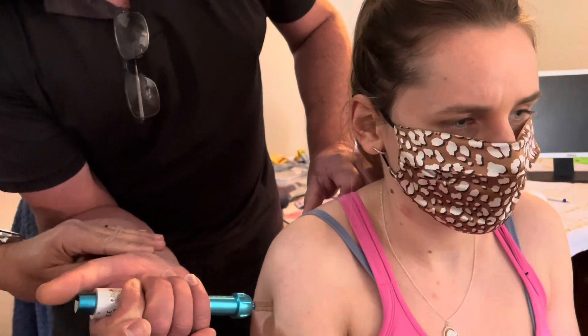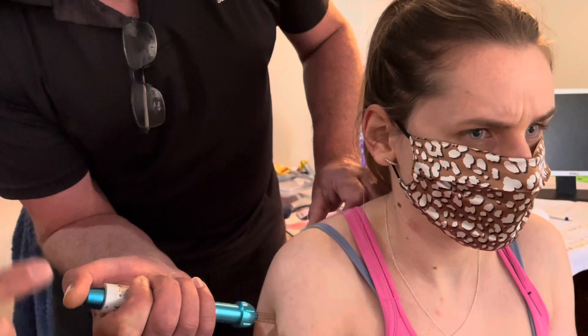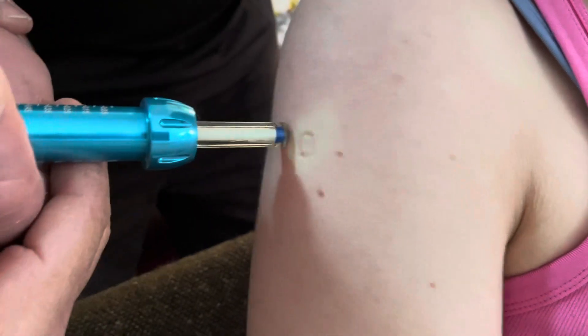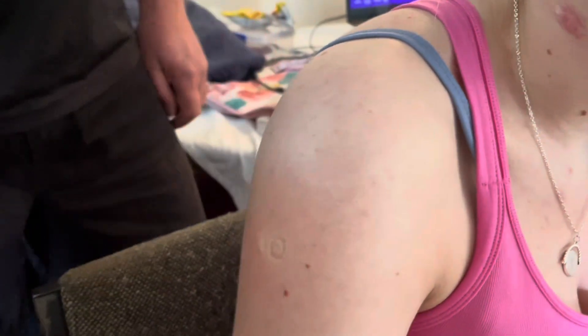Apply maximum comfortable pressure — are you comfortable? Place your thumb there and release. After you release, keep it there and massage the spot. Let's have a look — all the way in, not a single drop out. How does it feel? It's kind of like someone flicked you with a rubber band.